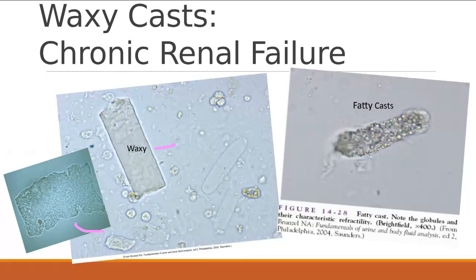This fatty cast, they're refractile. They don't look like red blood cells. They look funny. Remember, sometimes things look a little wacky, for lack of a better term. And they kind of have a shine to them.